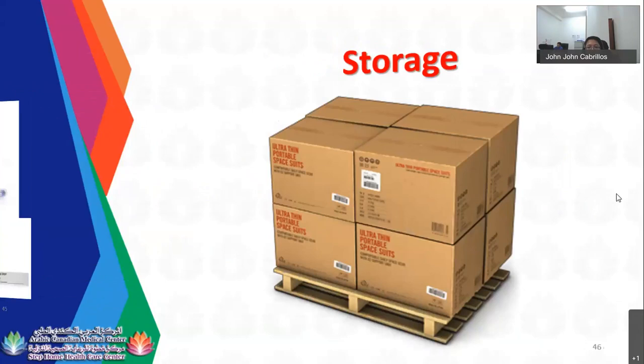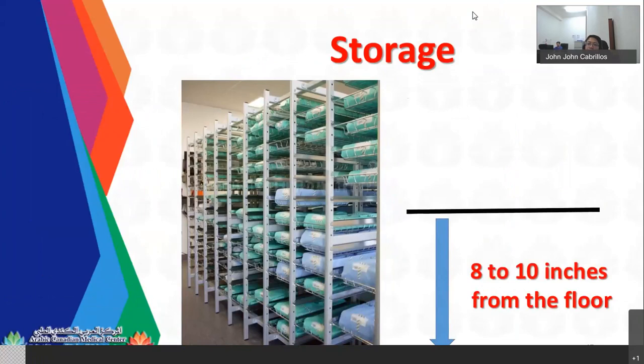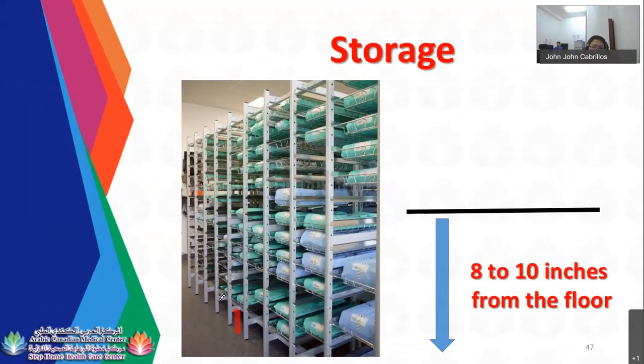So for storage area, this is your CSSD shelf, okay? So your shelf should be 8 to 10 inches from the floor, which means for this area, it should be 8 to 10 inches. Okay? It should be 8 to 10 inches from the floor.